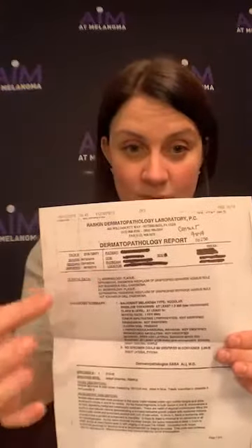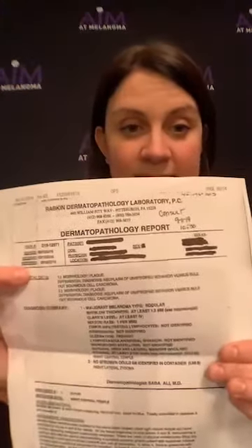So essentially, every pathology report has some type of path number or accession number. It's how they categorize and catalog everyone's tissue. You'll also see at the top, which is blacked out, all the patient information, and that would be you, the date that things were removed. And then the first thing that you see here is clinical data.